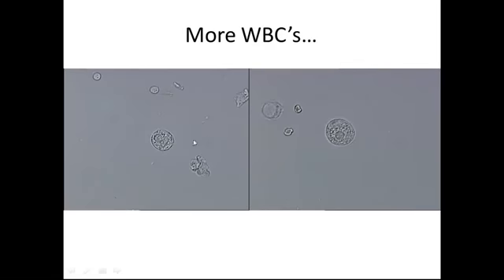So here are some more examples of white blood cells. Granulation, and here are some with the nucleus that you can see. Note the size of the white blood cell and how big it is. White blood cells are many times bigger than red blood cells. So this white blood cell is huge, and then here you have a red blood cell. Note the difference in size between the two. Also, note the concaveness of the red blood cell. White blood cells do not have that.